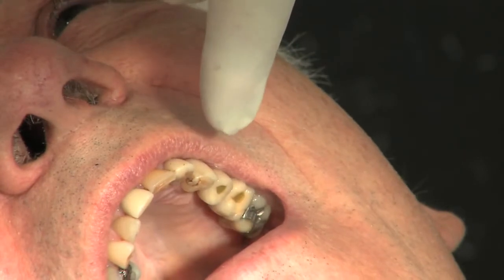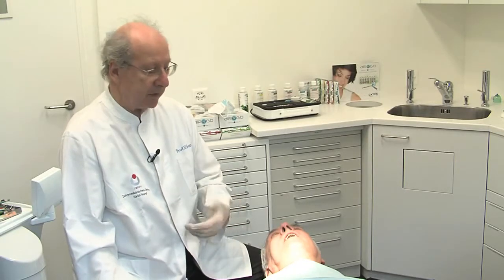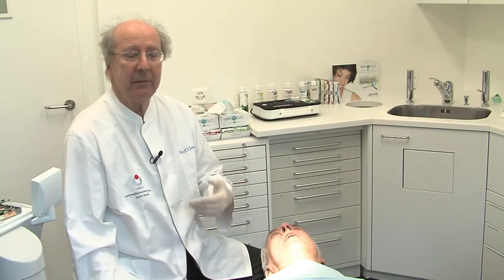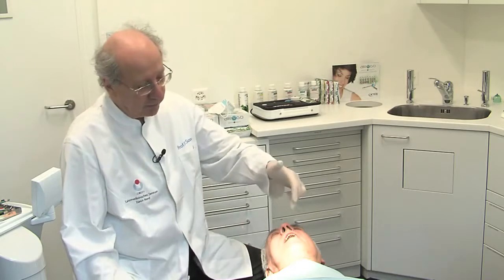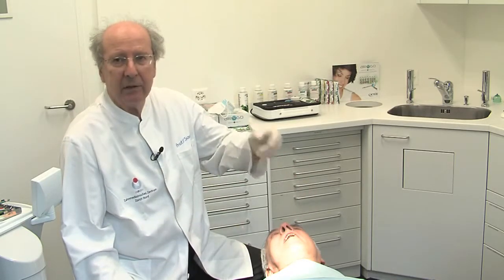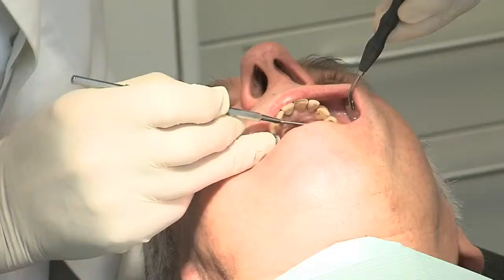The implants are in positions 2-4 and 2-5. The patient was here for recall last week and was scaled — every normal condition has been done. Today we treat mainly the beginning pockets of the peri-implant area to conserve the situation.